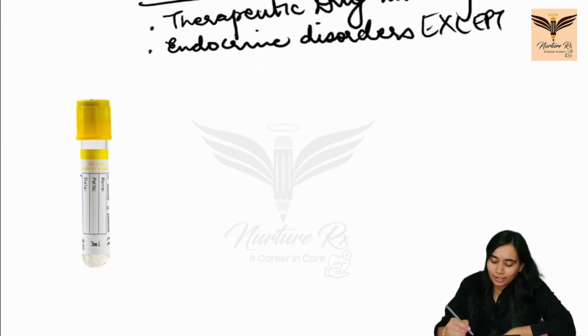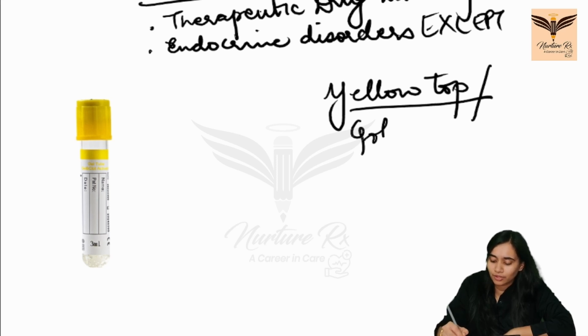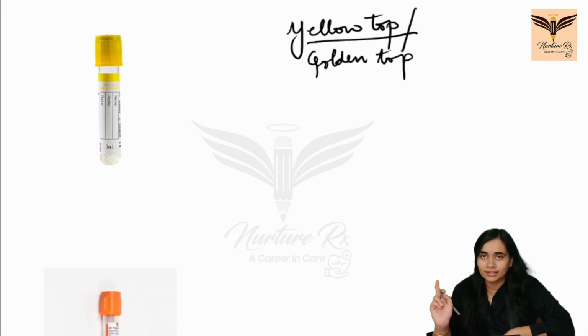This is your yellow top. Yellow top or golden top. Okay. So what is the difference between your yellow top and red top?